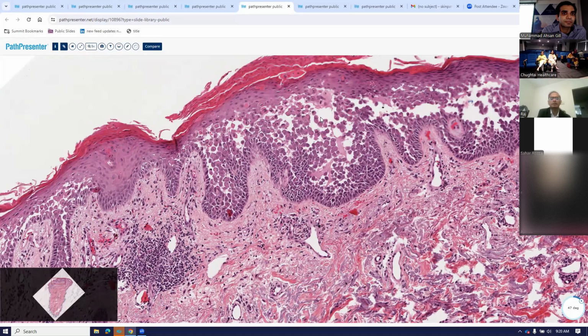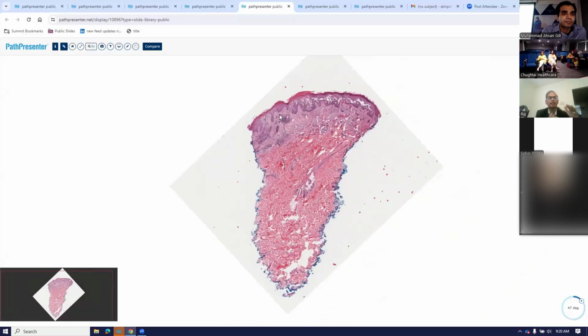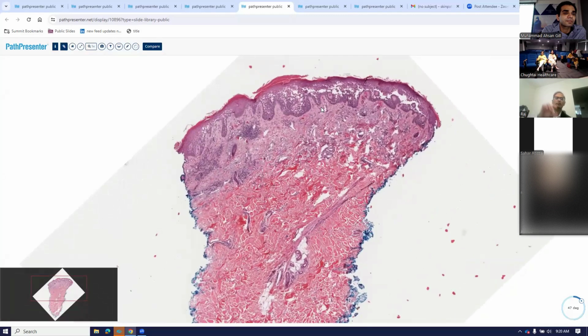And sometimes the other term that you're going to read in Hailey disease is a dilapidated brick wall. Dilapidated means a two-layer brick wall, like one layer on the top and another layer at the bottom, and these look like bricks basically. So this is a dilapidated brick wall. So an intraepidermal split, from one end to the other, that does not involve the follicle, and has this acantholysis. And if the immunofluorescence is negative, then you can call it Hailey disease.